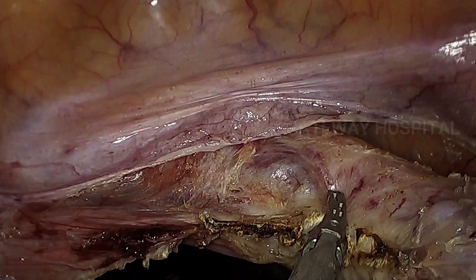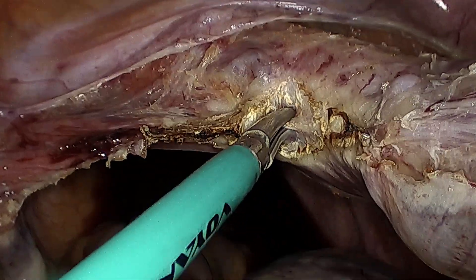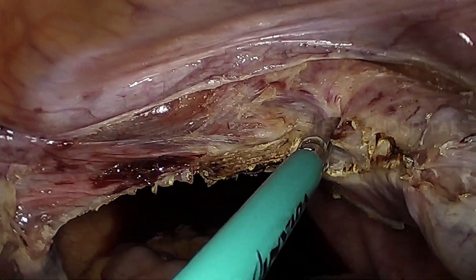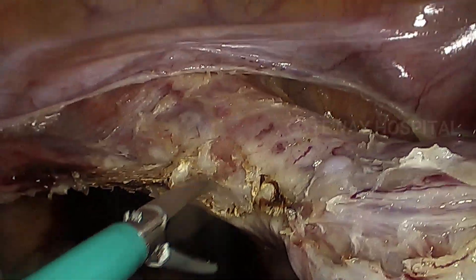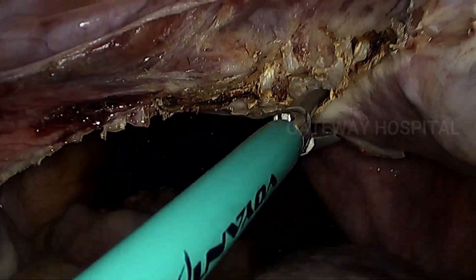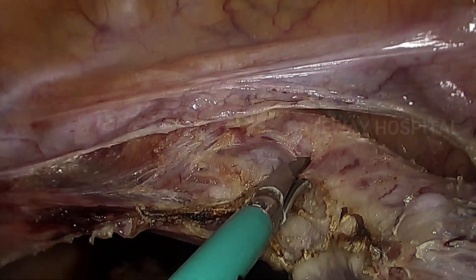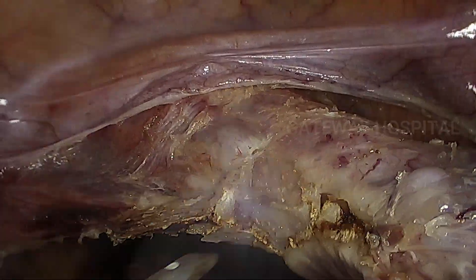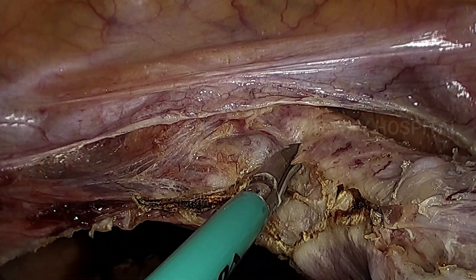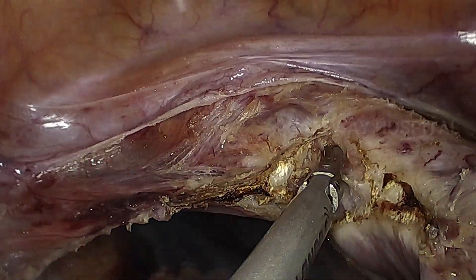This further division should be done up to the fornix. Meticulous hemostasis is very essential, and normally there will not be any blood loss in proper uterus removal surgeries. After doing the uterine vessel division on either side, we can proceed to the next step.